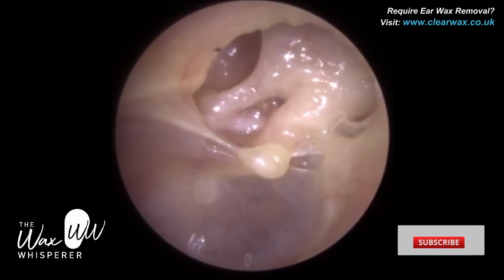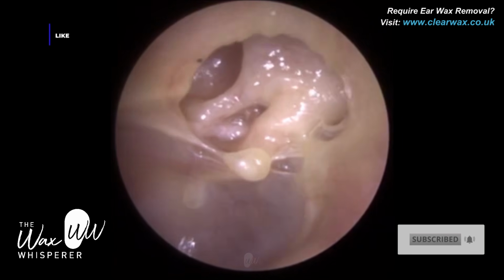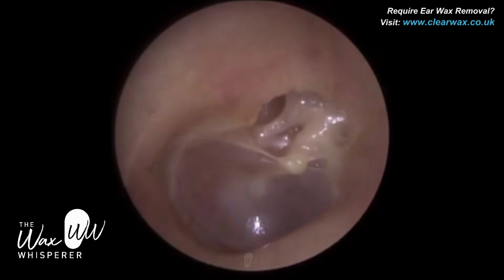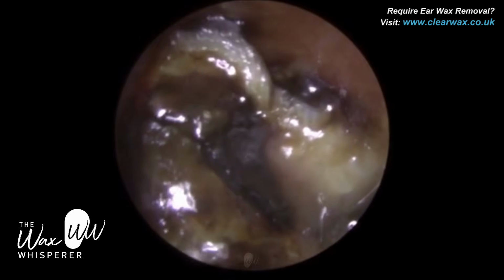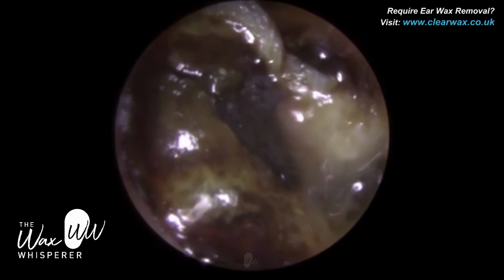But this patient also had a cholesteatoma previously in the right ear, and it's eroded the top part of the ear canal, and it's exposed all the middle ear structures. So here we can see the hammer bone, we can see the lateral process of the hammer bone, the neck of the hammer bone, the head of the hammer bone, and we can also see the anvil, which is including the body of the anvil. So we call the anvil the incus, the short limb of the incus, and the long limb of the incus.